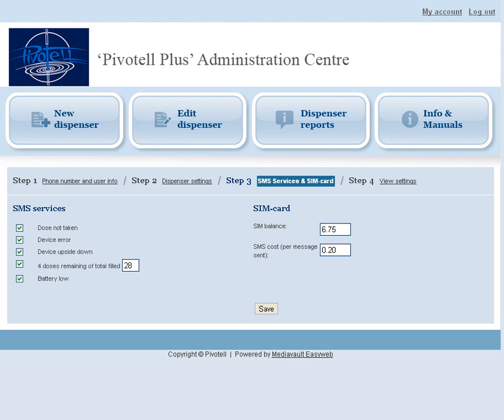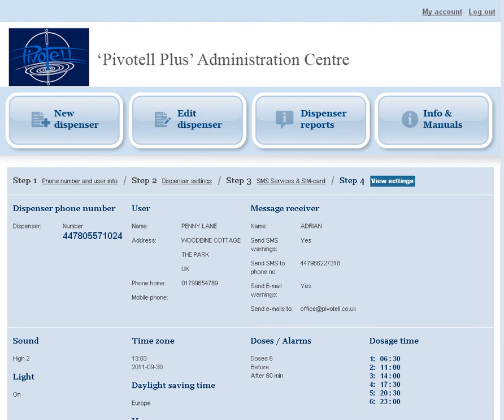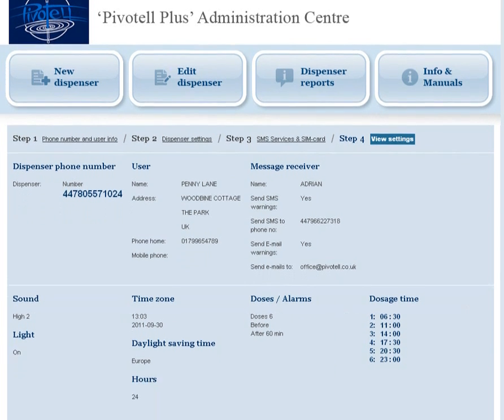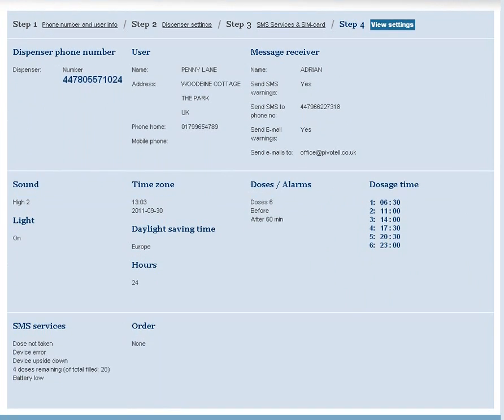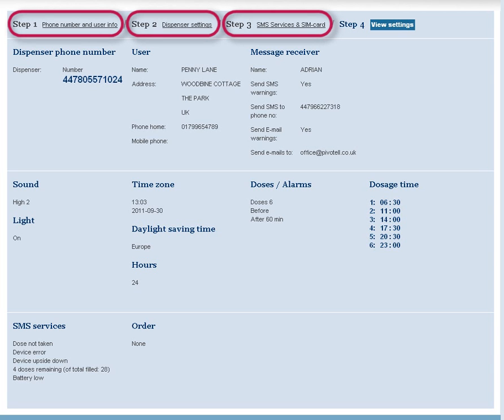The screen will then move to Step 4, View Settings, to view all of the settings on one page. If you need to adjust any setting, go back to Step 1, 2, or 3 and then click Save.